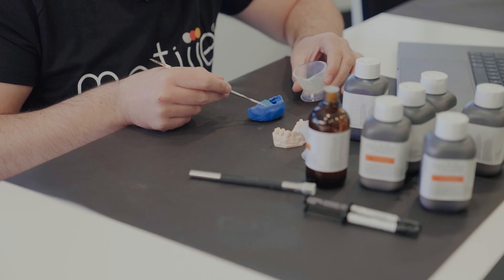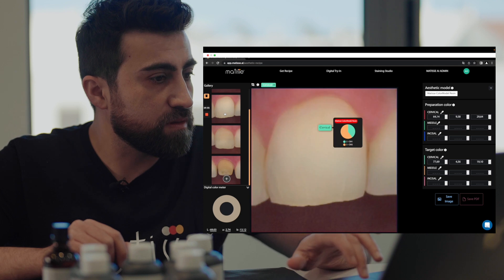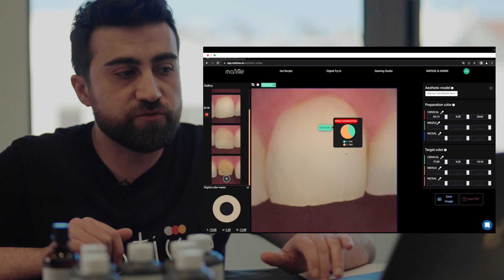We let it set, and then continue with the target teeth. The preparation color is now set — it took about five minutes. Now we will pour the mixture for the neighbor teeth using the target recipe, making a full model from canine to canine. The target tooth recipe is CM1 and CM2 at a ratio of 2 to 3.